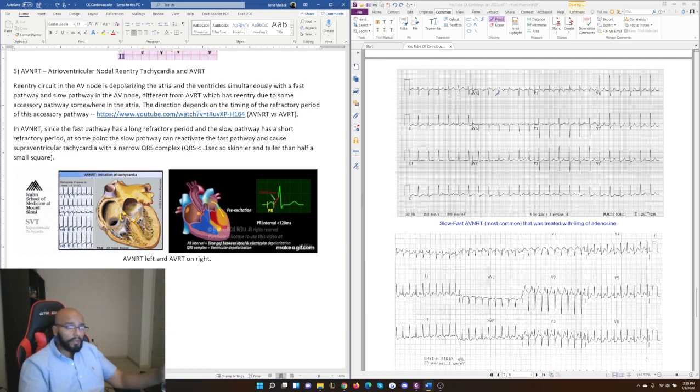This topic, how do you even get to this? Well, first things first, when you look at this, you can see this is tachycardia. We barely fit two boxes in between QRS complexes. But what else can you see here to actually pick AVNRT? Well, if your patient has no reason to have tachycardia, nothing fits. Like in the scenario I just discussed, we saw no reason for her to have tachycardia.